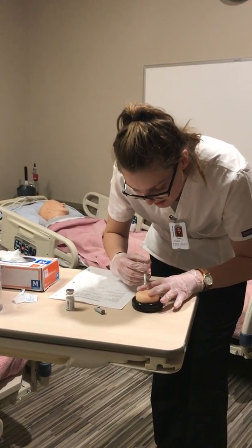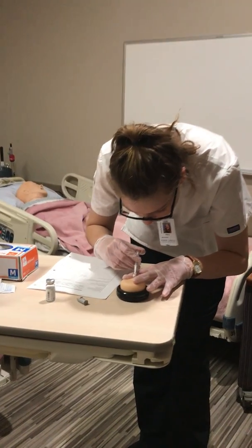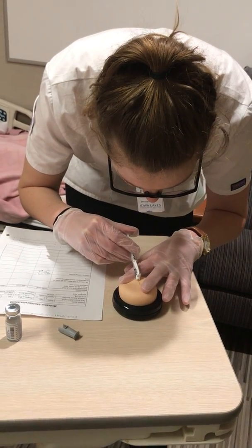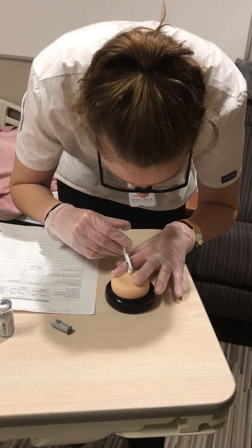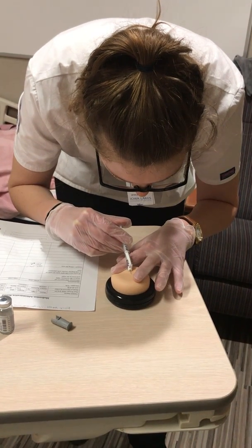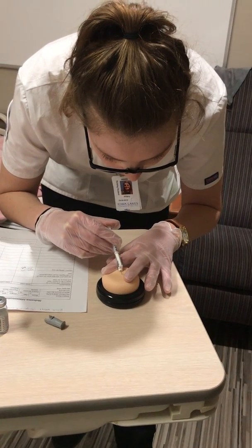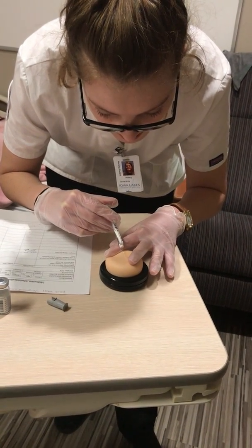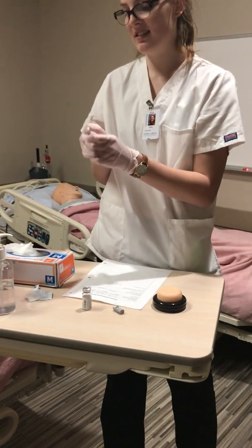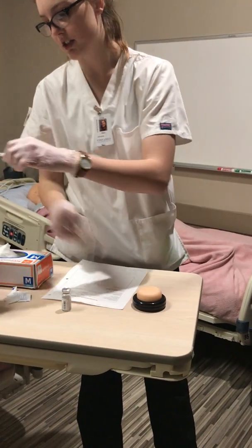So I'm going to kind of hold the skin. I'm going to insert it just under the skin. And you're going to want to get that bleb. I'm going to slowly insert it. Checked it for the time, and see we've got that bleb. 10 seconds. Then I'm going to remove it and immediately put the safety on and put it in the sharps container.